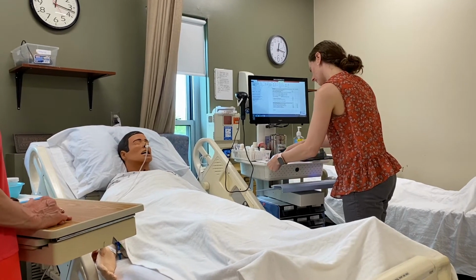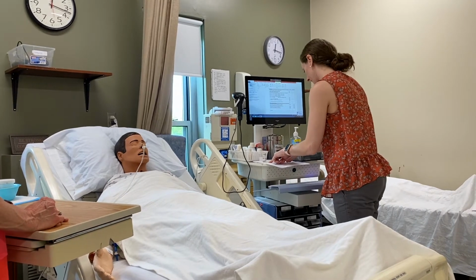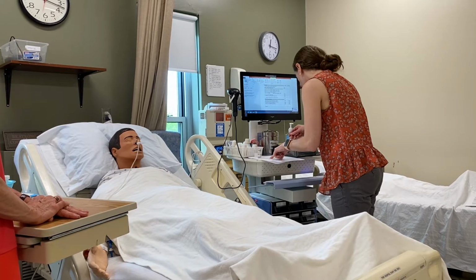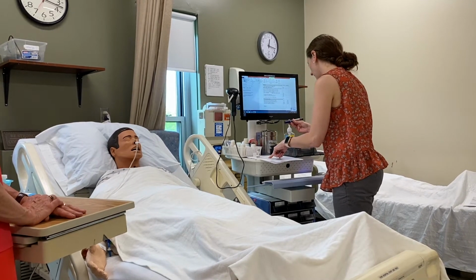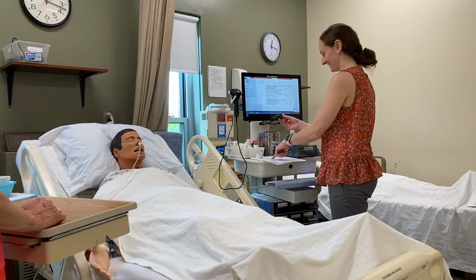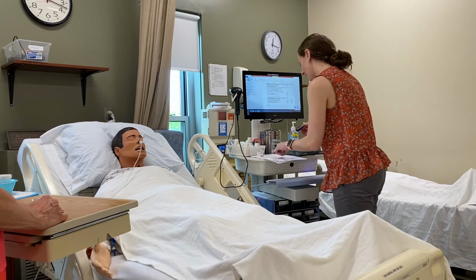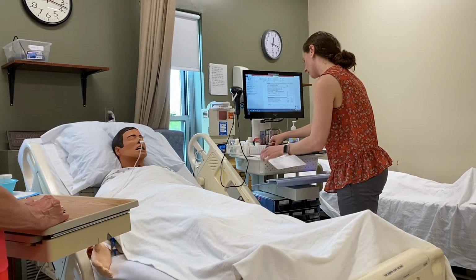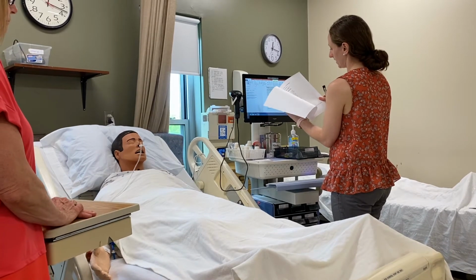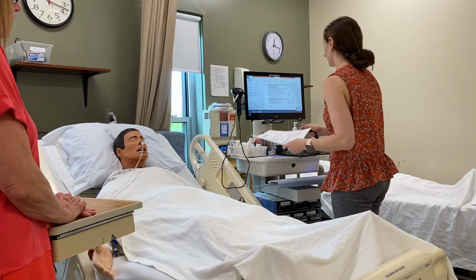Very good. When does that regular insulin peak, nurse? 2 to 3 hours. Very good, nurse. And then I'm also going to administer his Humalog, which is in a pen. Yeah, and that is a rapid-acting insulin. It is. And when does that peak? 1 to 2 hours. Very good. And his sugar was 234, which is a sliding scale. Correct. And so I will be administering 4 units.